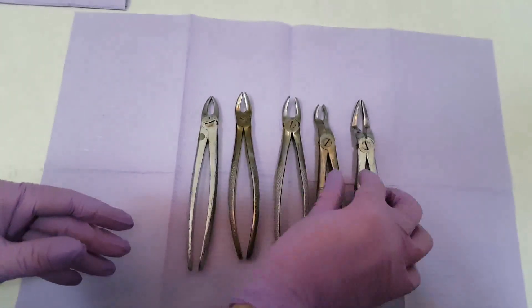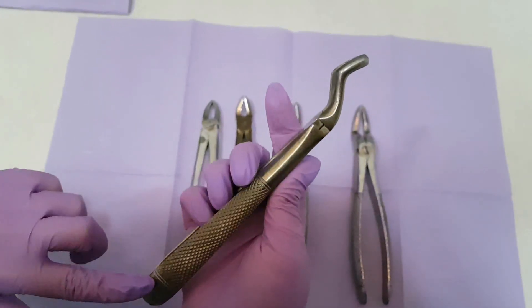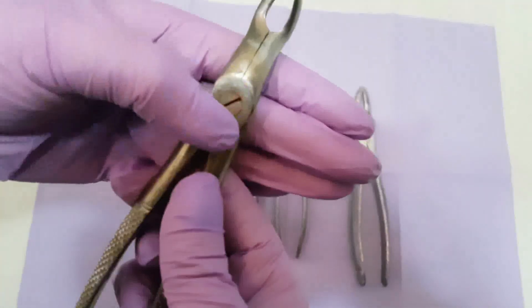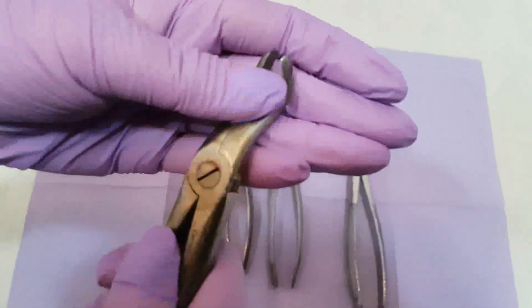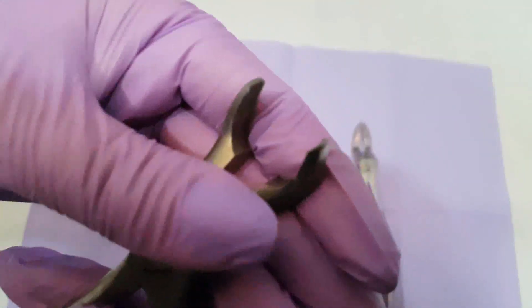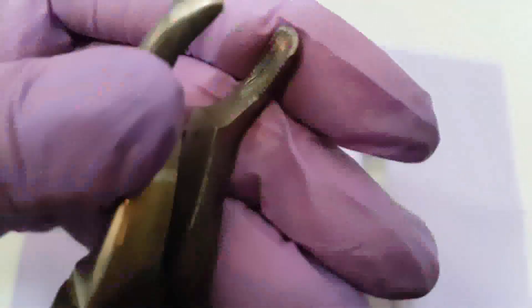Next I will show you the forcep that is used to extract the third molar. It has a form that is different from all the others so you can't mix it up. The working handle is bigger than the others because we need more force to extract the third molar. This is the hinge and these are the working beaks. The working beaks have this form because of the position of the third molar. When we open and close it, the working beaks do not close all the way because we need the third molar to be grabbed properly.